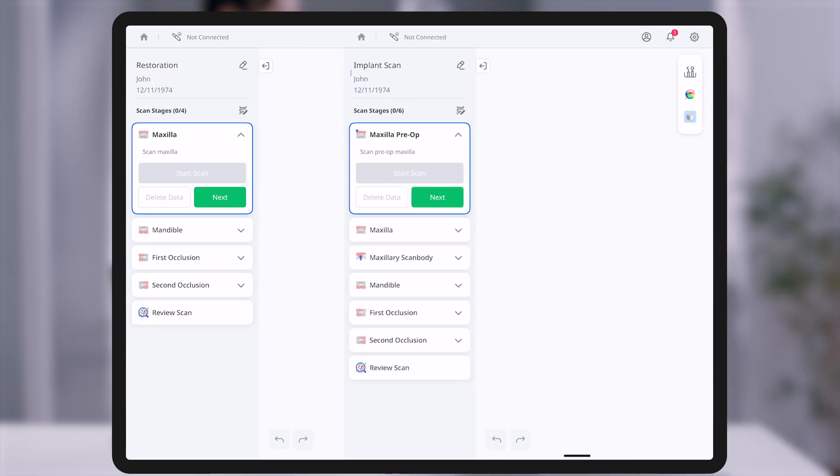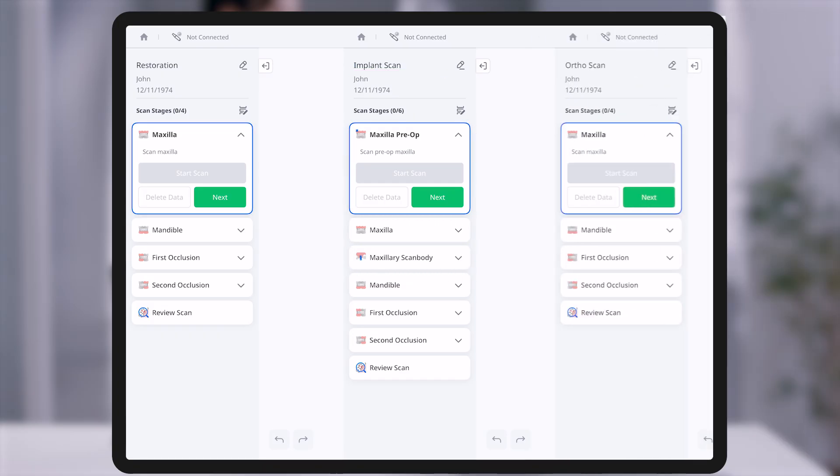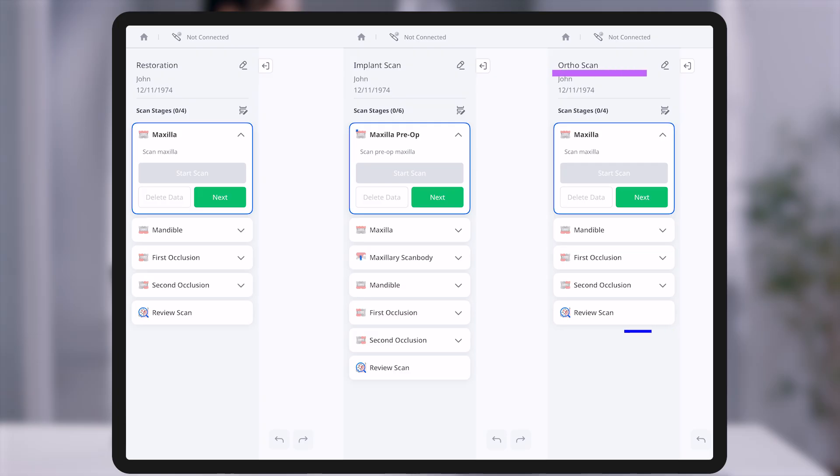Implant supported restorations adds pre-op and scan body stages, supporting accurate data capture for implant prosthetics. Orthodontics is designed for full arch scanning of both jaws, optimized for orthodontic treatment planning.